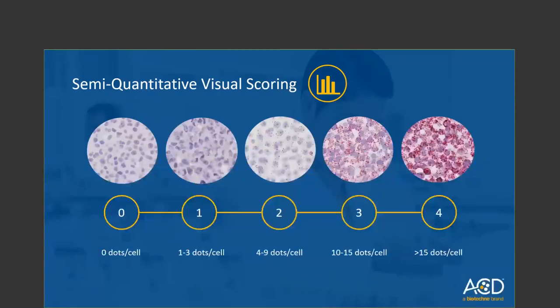I hope everybody is safe and healthy. I am Dr. Farhad Mustafa, and I will walk you through the methodologies we use for quantification of the data we see on our images. The most commonly used scoring system is the semi-quantitative visual scoring. Performed by our highly trained experts, it is a rapid scoring system that shortens turnaround time. We provide two things: the expression level and the percentage of positive cells. As you can see on this slide, cells moving from left to right show increasing numbers of dots per cell. Cells with no signal are scored as zero, and cells with more than 15 dots per cell are scored as four.